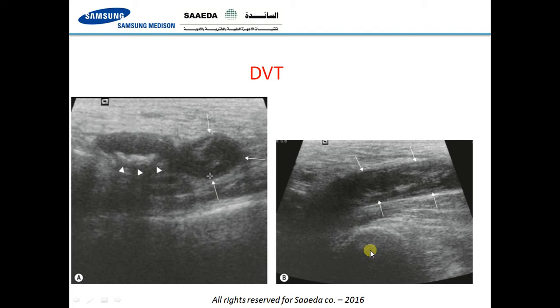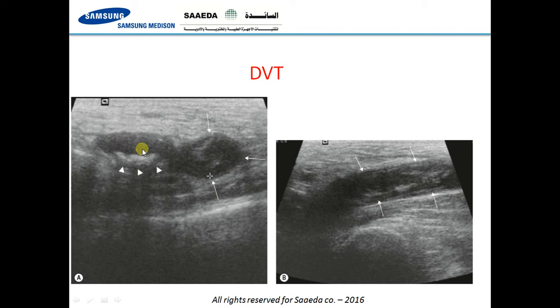Compressibility is by far the most important sign to diagnose deep venous thrombosis, and it does not even require Doppler examination — we can diagnose loss of compressibility without using Doppler. For example, in this case you can see the vein has echogenic, heterogeneous internal echoes. With compression applied, the artery is slightly narrowed with atherosclerotic calcific foci on the wall, while the vein shows no signs of compressibility — diagnostic of venous thrombosis.